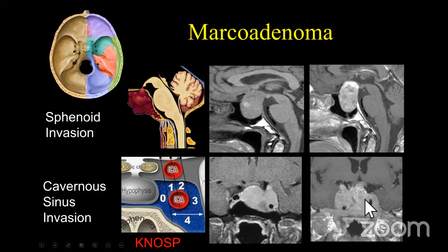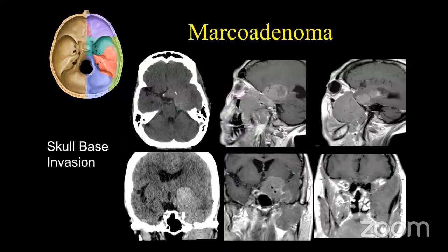I'd be curious to see if most of you use this classification, or you just look at it and make your own determination prior to your surgery. But in general, MR is pretty good at looking at those classifications of grading these macroadenomas.